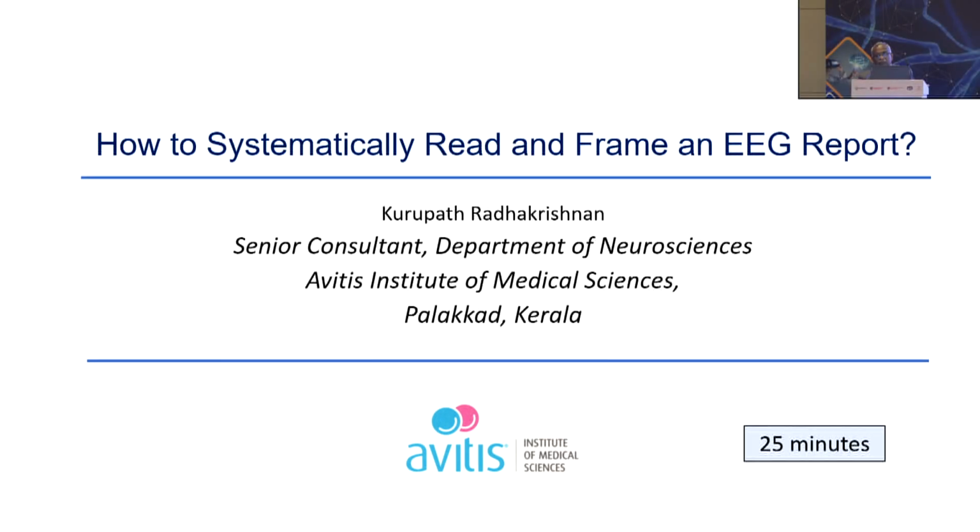The whole purpose of this exercise is ultimately to interpret the EEG and translate it into an EEG report, by reading which the referring physician or the neurologist or psychiatrist or pediatrician, whosoever has referred the patient to you, should be able to get information regarding the diagnosis based on which the management can be initiated.